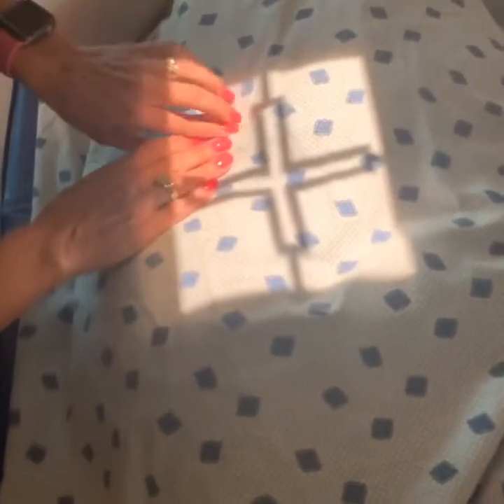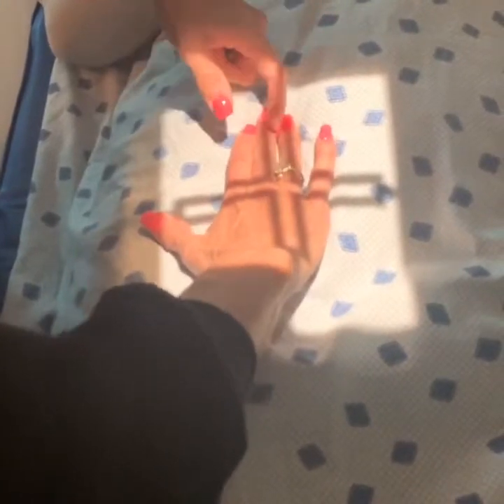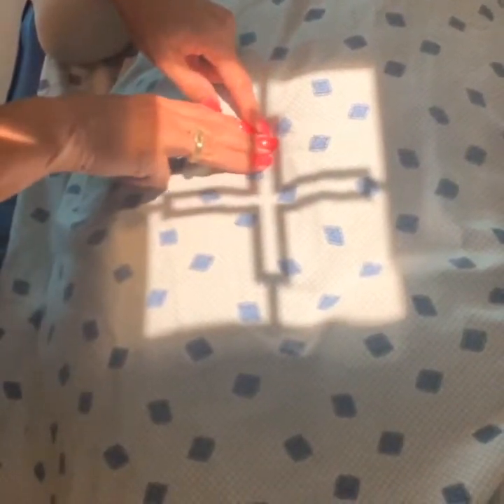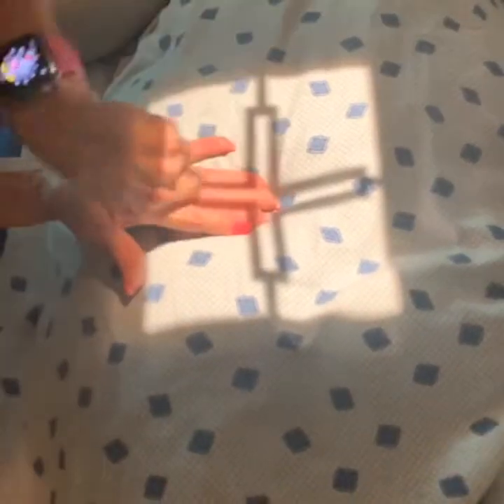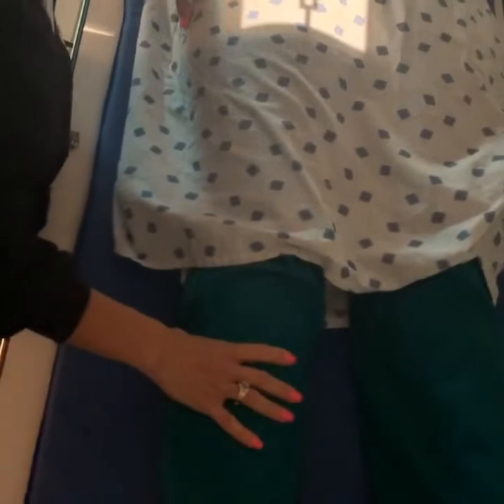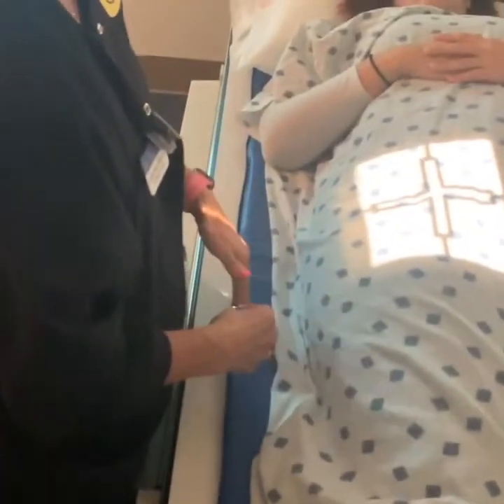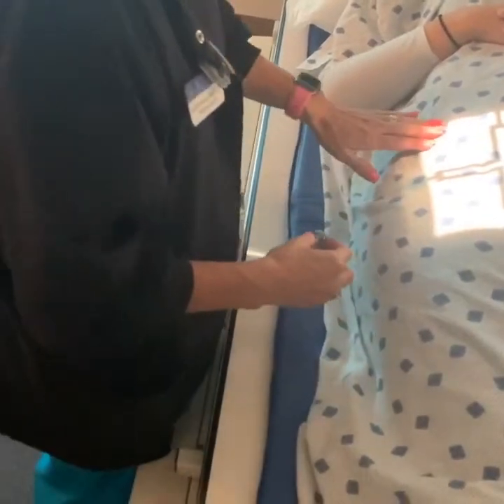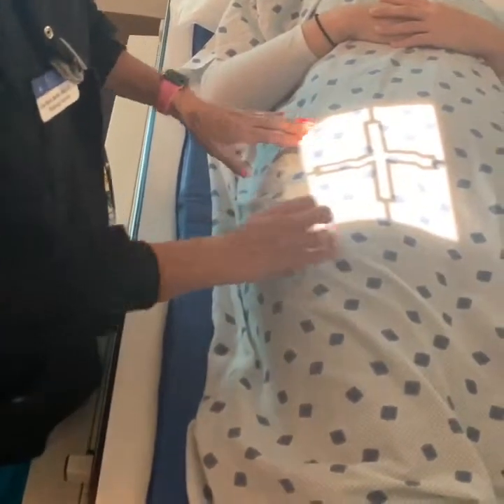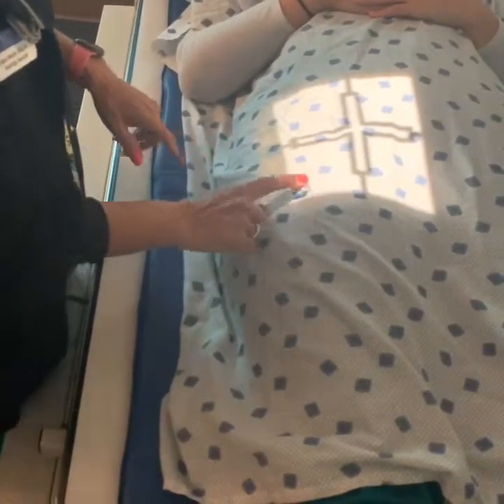So you find ASIS. It's 1 to 2 inches medial. That's probably 1.5 would be my guess. And then 3 to 4 inches down. So that's 2 inches. That would be 4 inches. So I'm probably about 3 inches down on that. I'm gonna go back and internally rotate 15 to 20 to get the femoral neck parallel to the IR. I'm lined up there. And on this one, since I don't really have light field on the table, I'm just gonna go ahead and put my marker, I probably have overlap there, so I probably put it low, just like that. As long as she doesn't have a prosthesis that would get in the way, I'll put it right there.